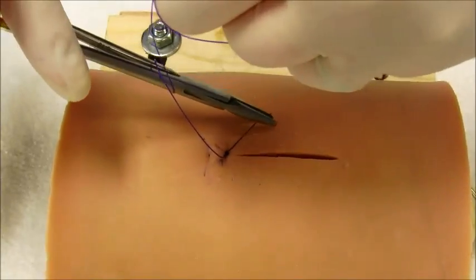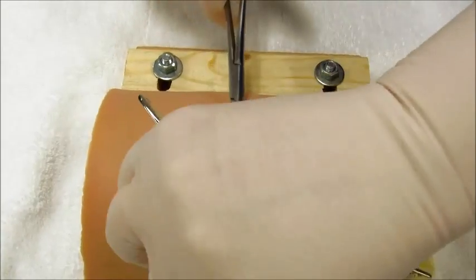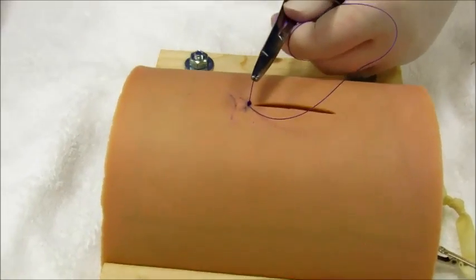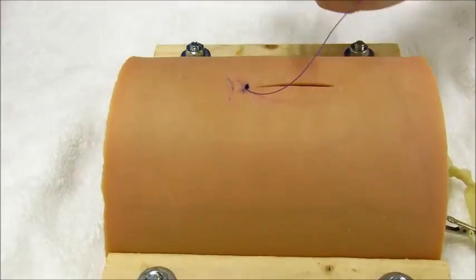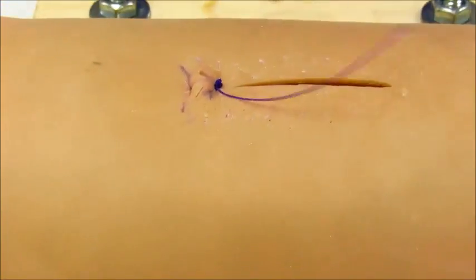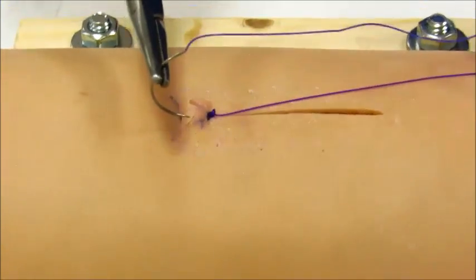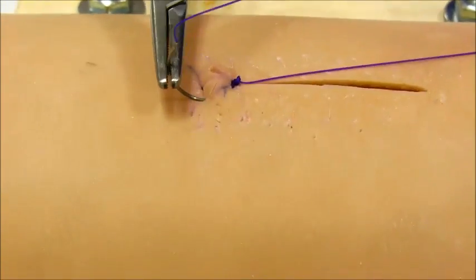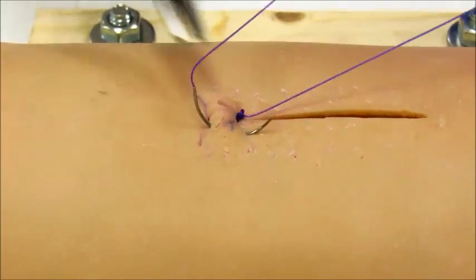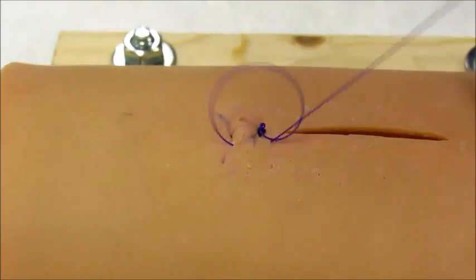They won't always bury perfectly, especially in the silicone models. They should in tissue. One thing you can do though, which I'll show you, is if your knot is sticking out a little bit, especially on your first knot, your starting knot, you can over sew that knot. So I'm just going to come back with my first bite, and when I pull on this, it'll invert the tissue over the knot.